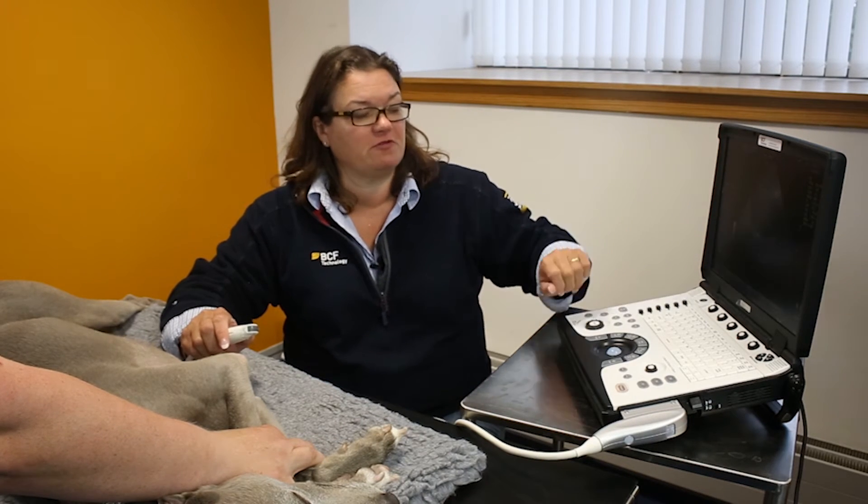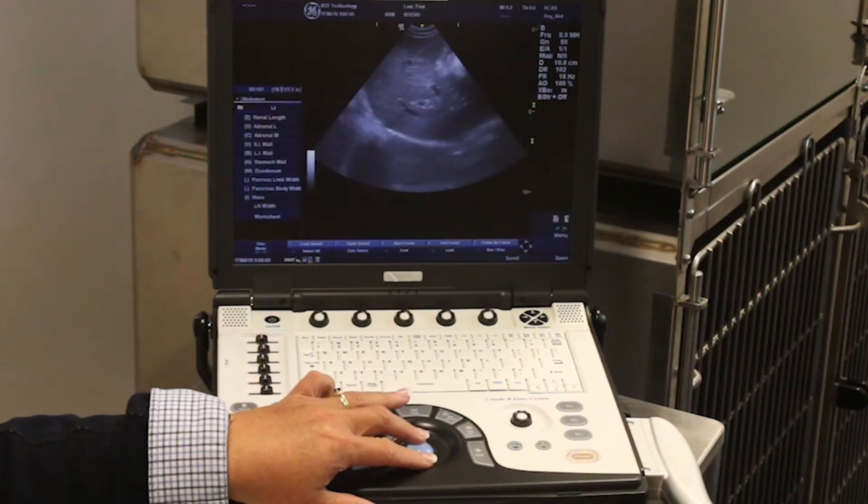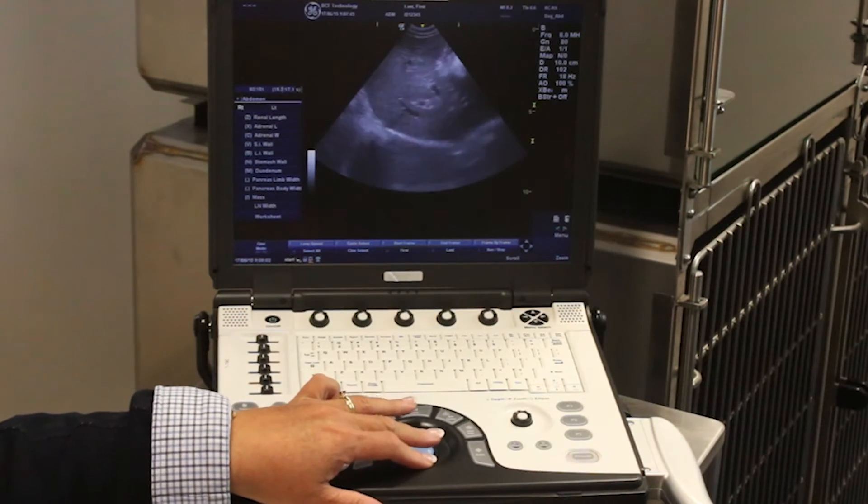The fact that you've got a buffer running means that you can scroll back frame by frame using the trackball to get to exactly the image that you wanted to save.